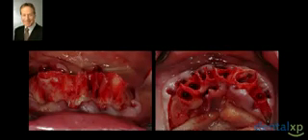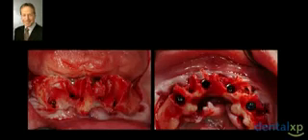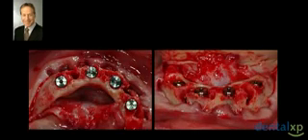This is after the teeth are extracted. How are we going to navigate through this mouth to place implants, reduce the bone, provide an immediate load prosthesis, have the patient leave happy and pleased? So we use our surgical guide. This surgical guide commits us to being able to develop osteotomies within extraction sites at precise locations, ultimately placing the implants below the crest of the bone, which then leads to, and you can see the bone levels here, substantially longer implants, and ultimately reducing the bone levels and then going ahead with some bone grafting in this particular area.